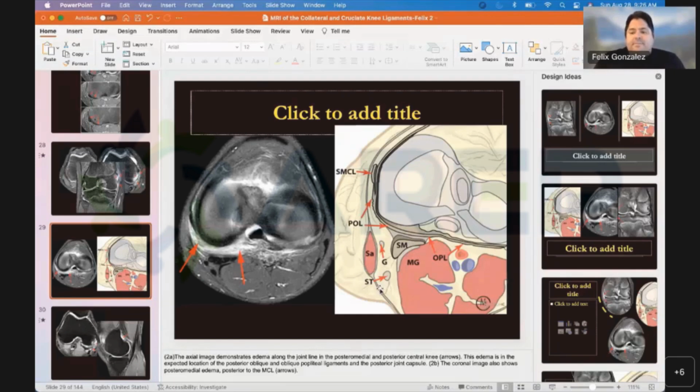Okay. Any particular pulse sequences or planes that you need, or is it just a routine or regular plane and sequence? Usually I'm used to the regular plane. I know that some institutions have instituted the oblique ACL plane, where they see the ACL profile. In my opinion, if you look on the axial and the coronal, using standard imaging is enough.